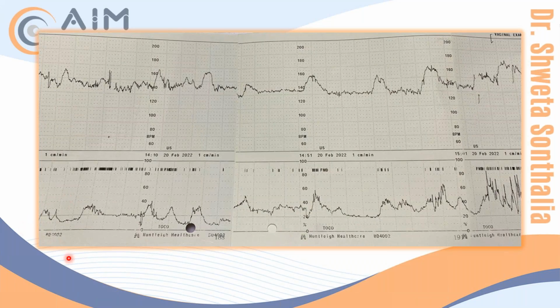Okay, now this one. This is from Saudi Arabia, fresh. This is a different machine. If you see here, there is no line but dots. But again, this is a big box, and this is 5 beats, 10 beats, 15 beats, 20 beats. So a 20 beat difference, all same. Only in place of a line, there is a dot. Yes, anybody can take it.